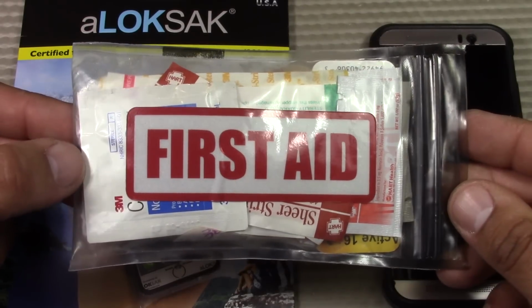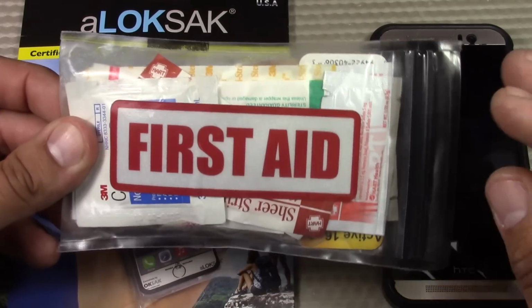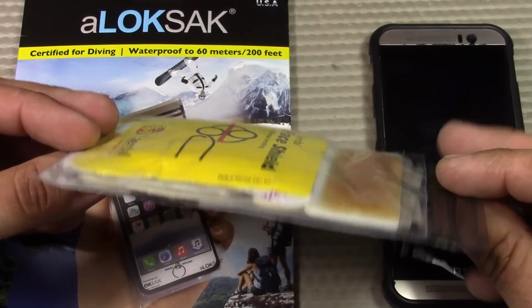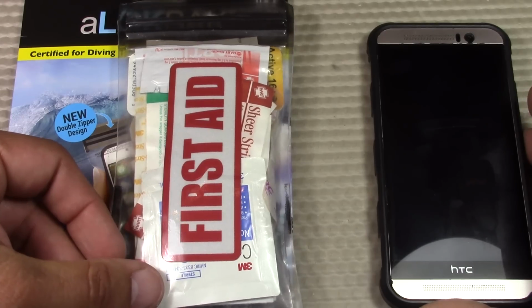These Mini Medi first aid kits provide a basic set of first aid supplies for EDC purposes. So nothing too major in here. You can't fit anything extremely large, but just small first aid items. It's around the size of a smartphone, as you see here.